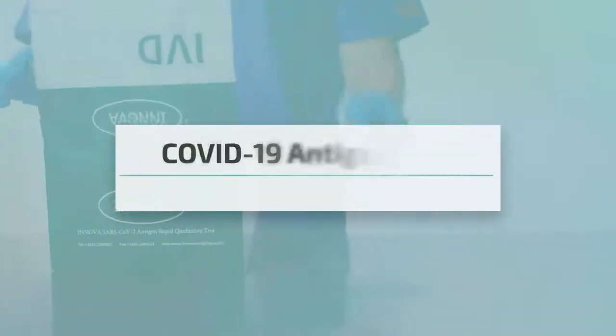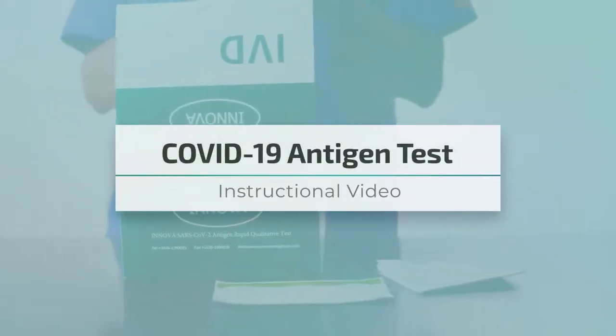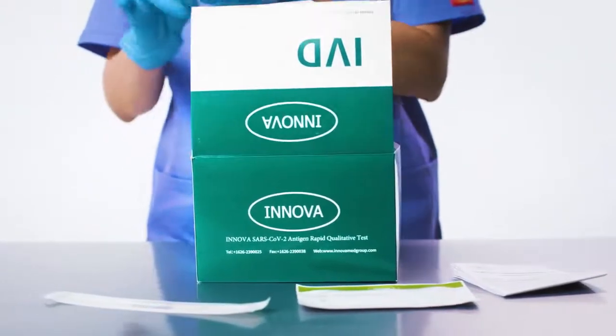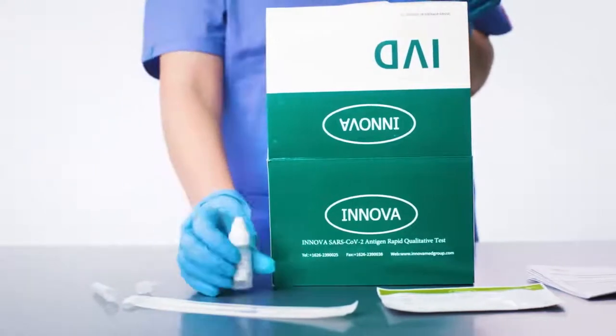Inova's COVID-19 antigen test is used to detect the presence of SARS-CoV-2 proteins through nasal or throat swab specimen collection. The test can be easily used without the need of additional equipment. 20 minutes is all it takes to accurately diagnose an infectious person.